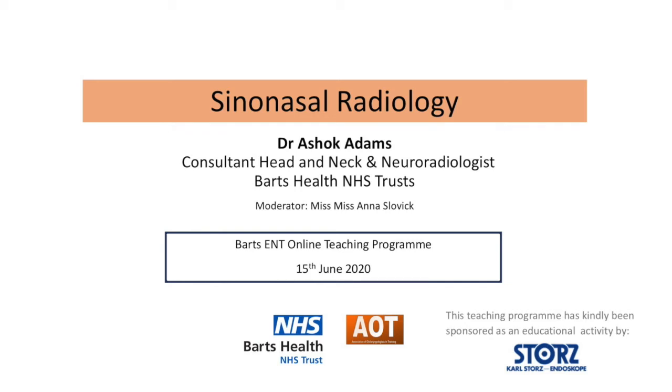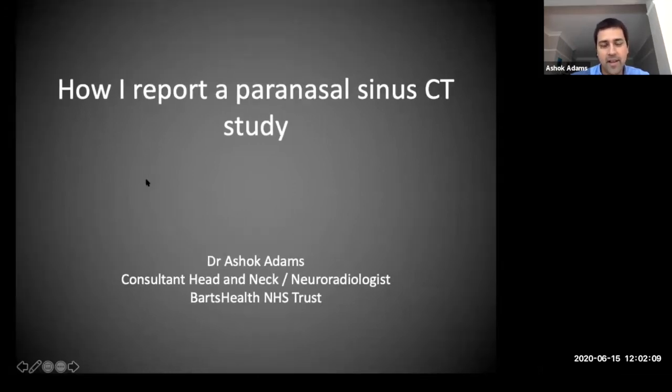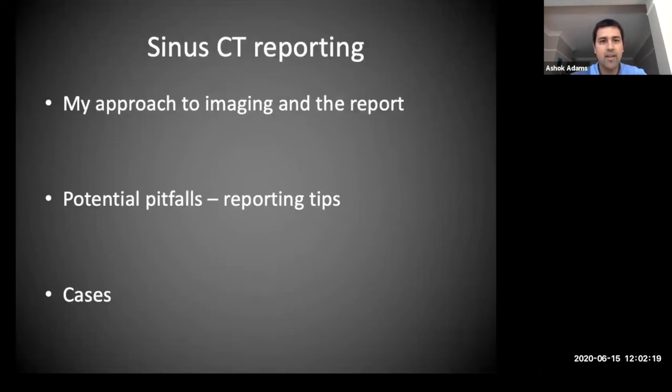What I'm going to do is, for the first 20-25 minutes, just give a broad outline of how I report sinus CT, and then go through 9 or 10 cases which are quite interesting, which are probably the best part in terms of take-home messages. So I'll freely admit that, relative to temporal bones and other head and neck, this is not my favored area, but it is our staple diet.